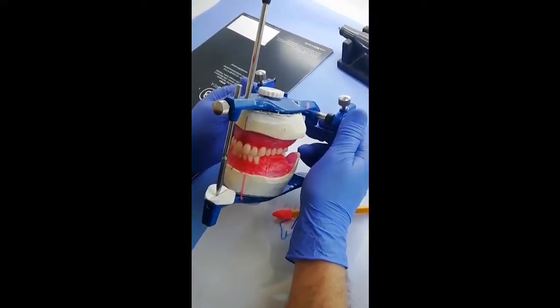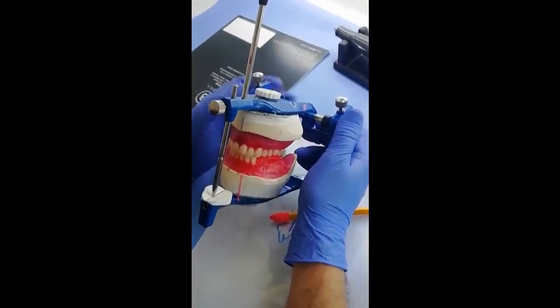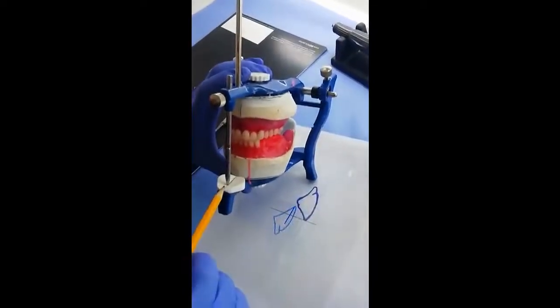And this means that the incisor guidance angle of our sitting is the same as the inclination of the incisor guidance table.